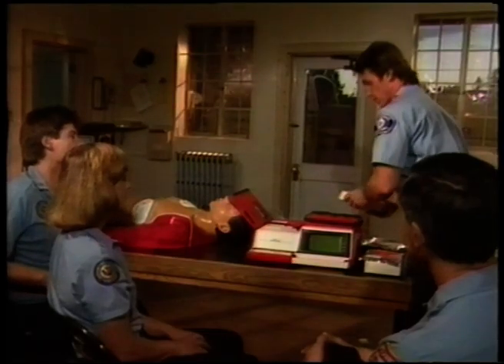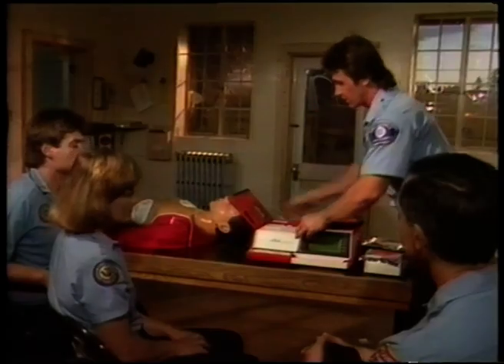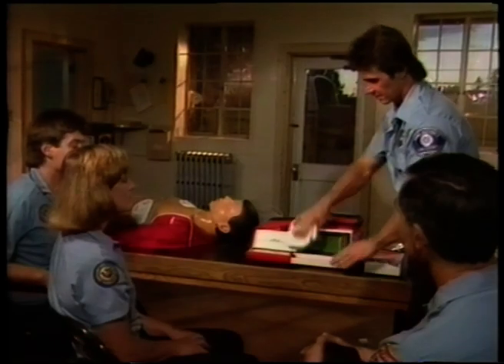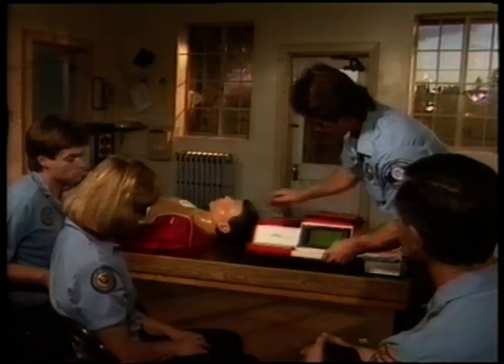Replace the depleted battery pack with a fully charged, properly maintained battery and recharge the depleted battery. Do not wait for the low battery or replace battery display message to occur before recharging your batteries. Remember, it takes approximately 16 hours to recharge a depleted battery pack. Recharge the spare battery if used. Clean the unit and examine the case and cables for breakage and immediately report damaged items.